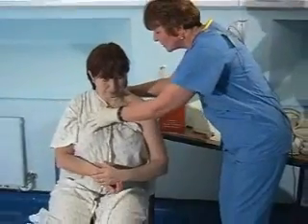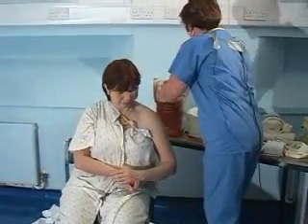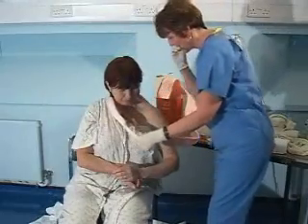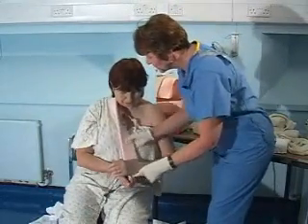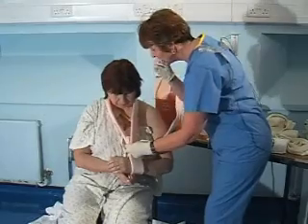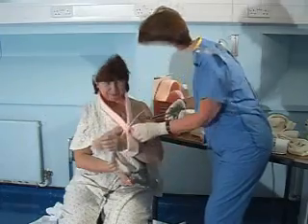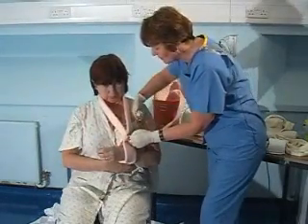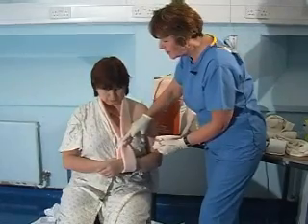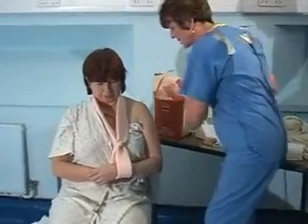I'm going to get my patient to hang over sideways a little bit and put a collar and cuff on her, so then if she needs to let go of the arm she can. We just measure first of all the collar and cuff — you should measure it before you cut it to save material. I've just tied the collar and cuff before cutting it. Take the collar and cuff down as close as you can because sometimes this bit can dig in the patient. Get that ready first and then look at the arm.